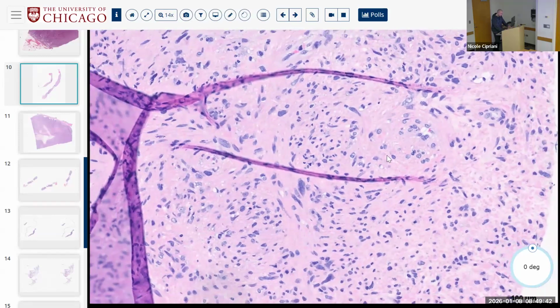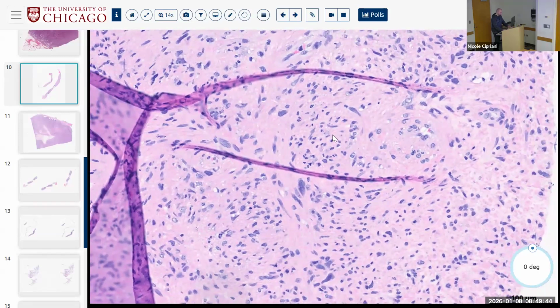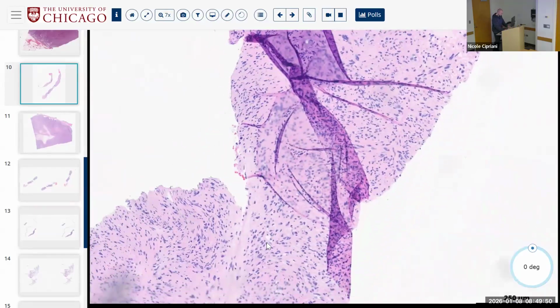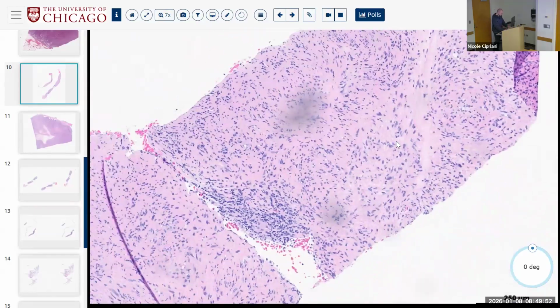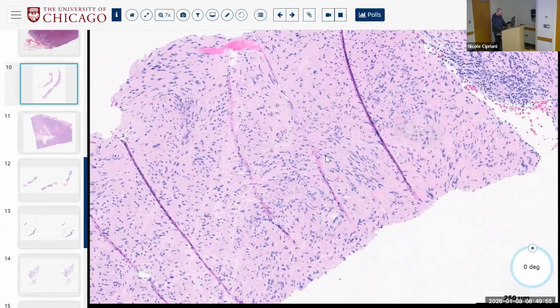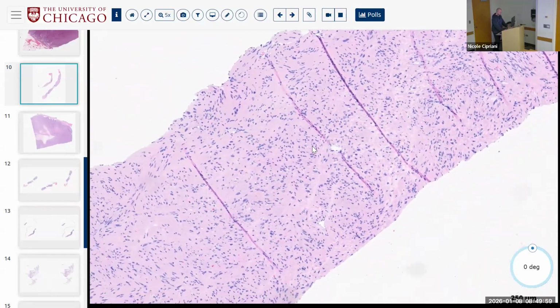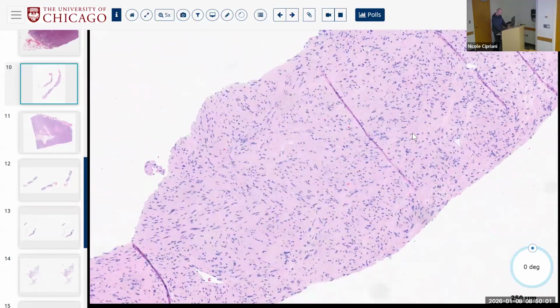These right here, whirling around, gave me a feeling like it's radiating out from something, and that's its growth pattern. So kind of like myopericytomas, or I didn't think I saw pecoma-type things, but it gave me a similar feeling of growth.